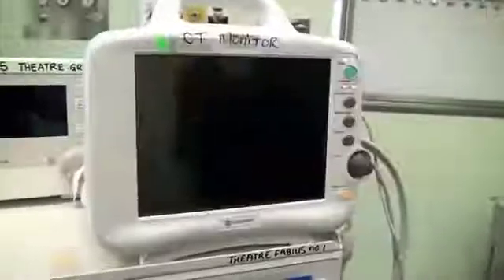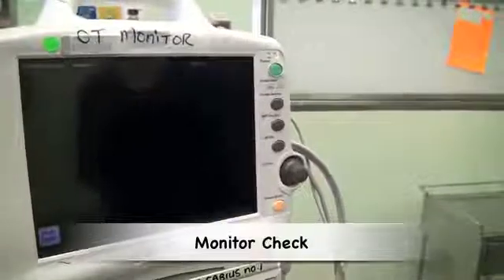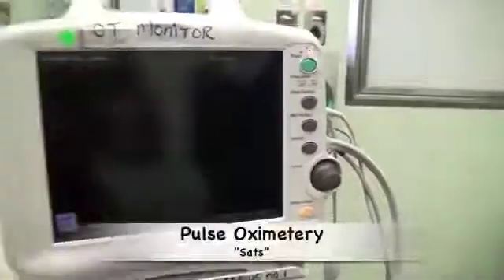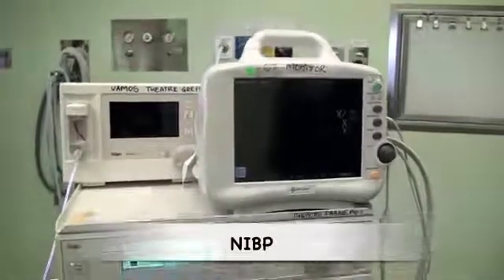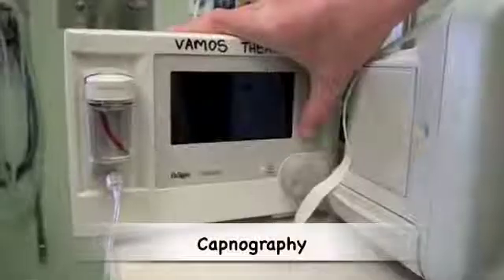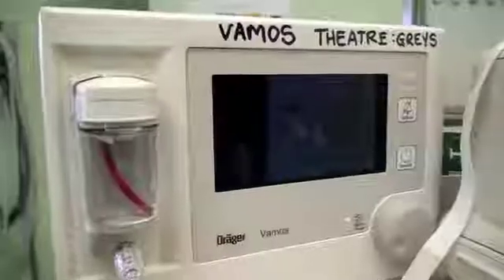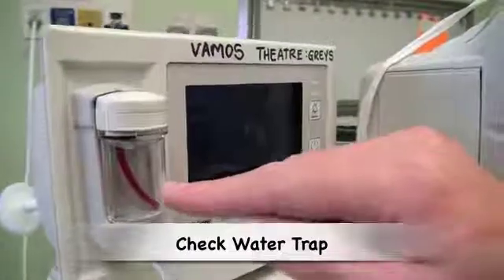The final part of the machine check is to check that the monitors are working. For most anaesthetics, this will include your SATs monitor, your non-invasive blood pressure monitor, your ECG monitor, and your capnography. The capnograph has a water trap; one needs to check that the trap is empty of water. One can check the functioning of the capnograph by blowing into the sample line, and we can see the capnograph is working.